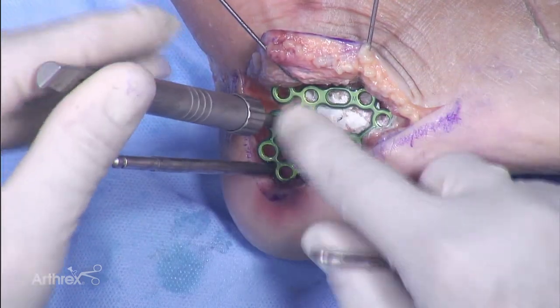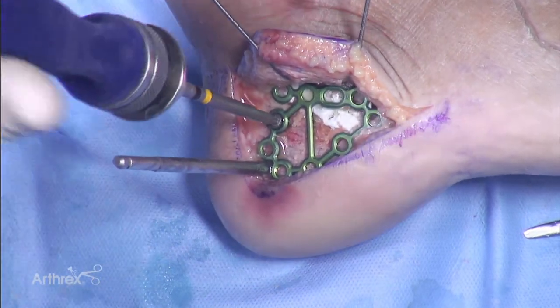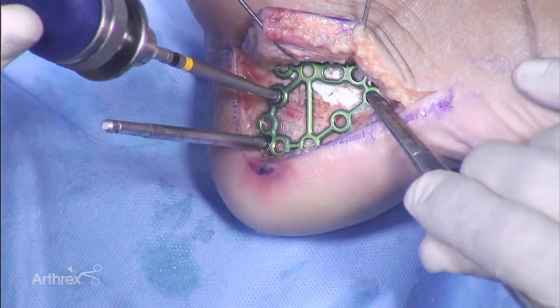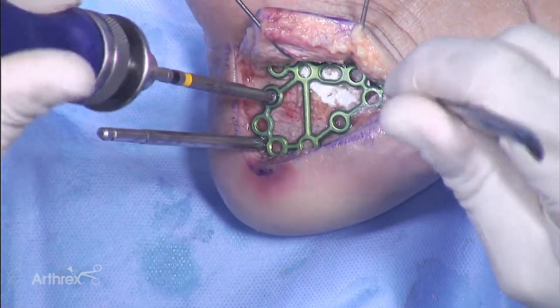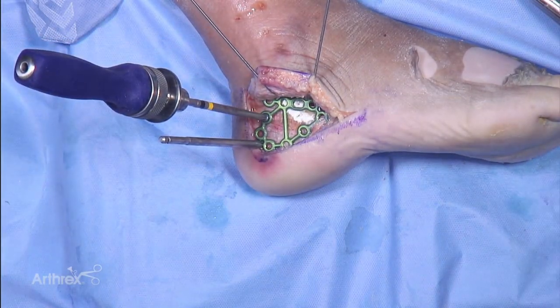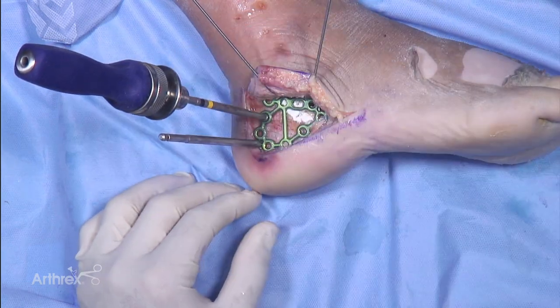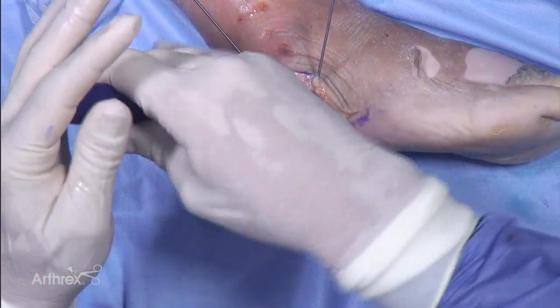I'll use the hand driver to seat that screw, bringing the plate down flush against the bone. Then I'll move up and place another non-locking screw more proximally. At this point I'll often get an x-ray because you can still rotate around the first screw to confirm nice positioning on the calcaneus. Once I get it where I want it, I'll set it in. That second screw brings the plate right up against the calcaneus across its length — it measures 34mm. Once I have a couple of non-locking screws in, I can go to locking screws for extra stability.